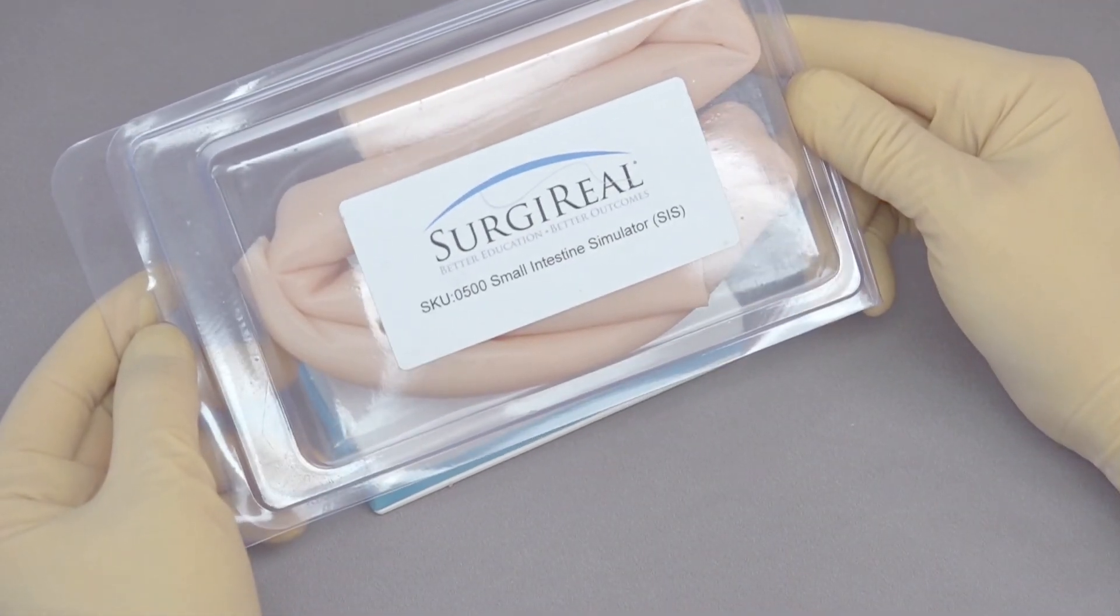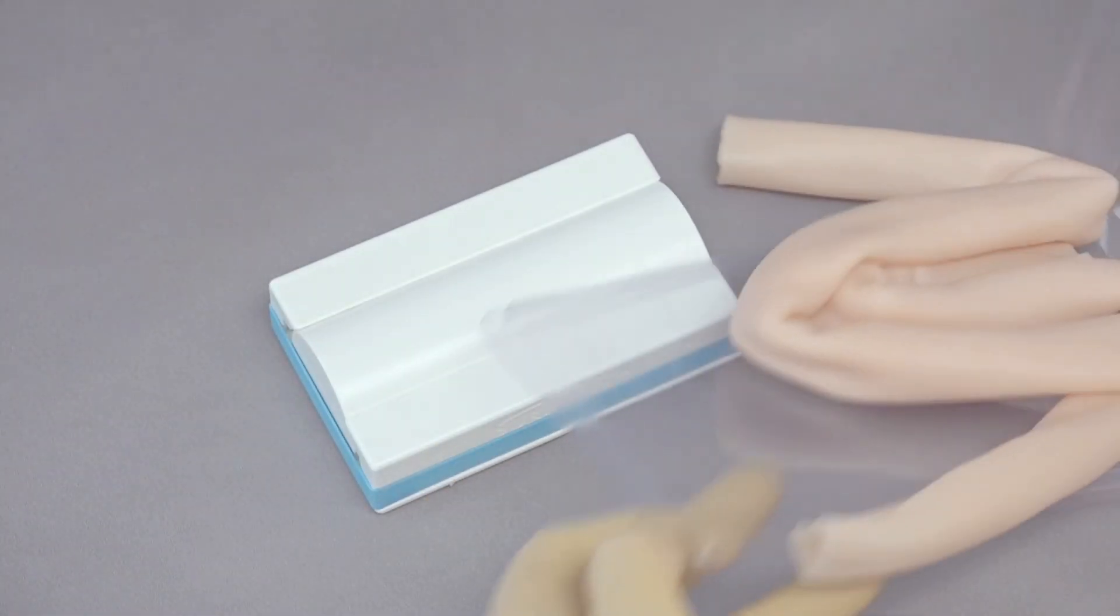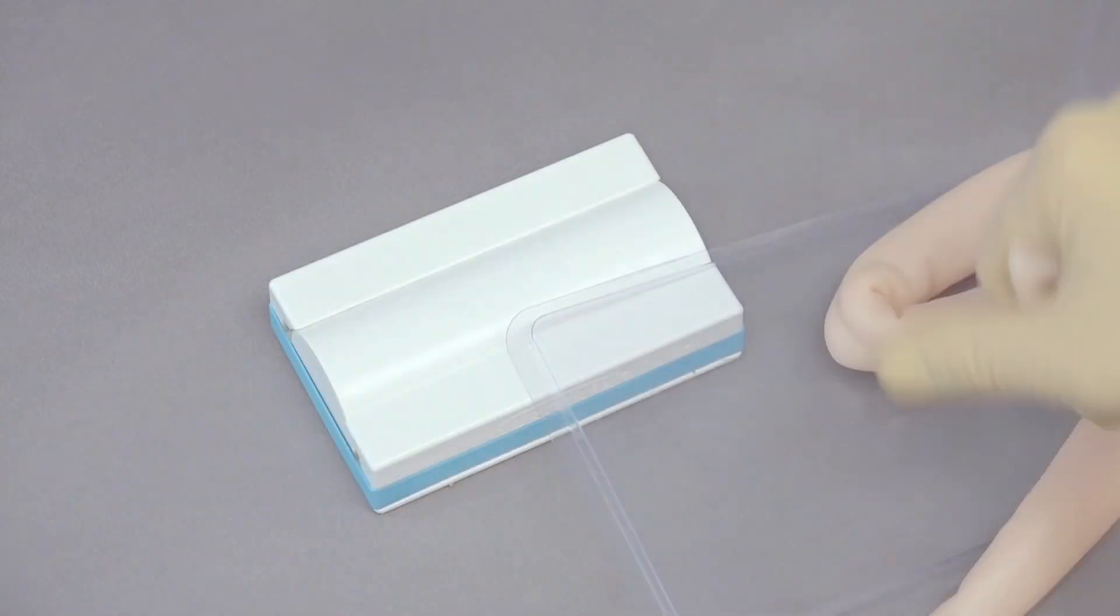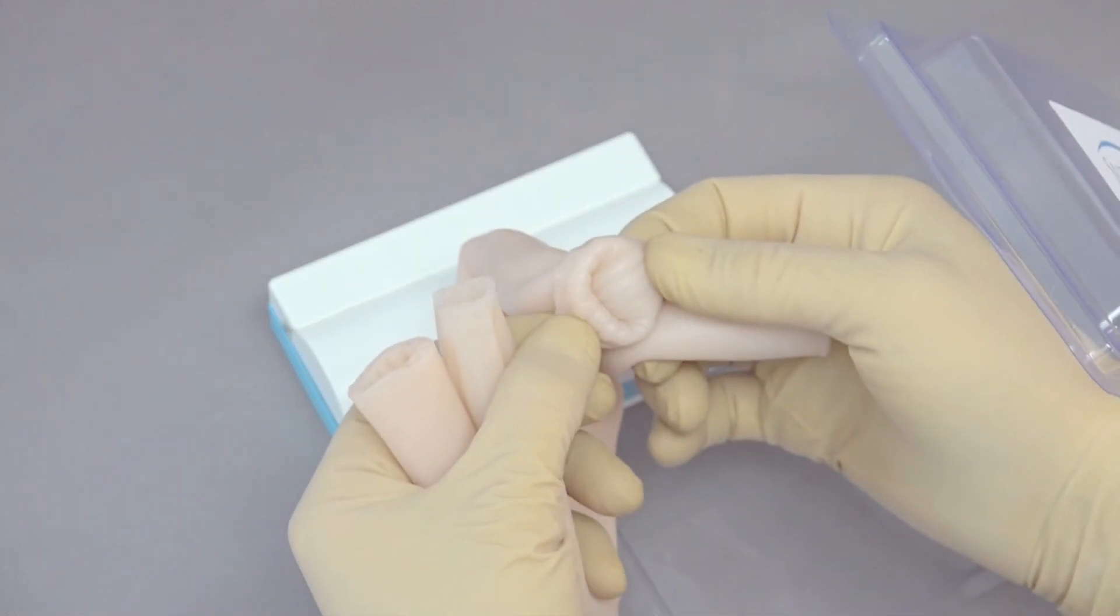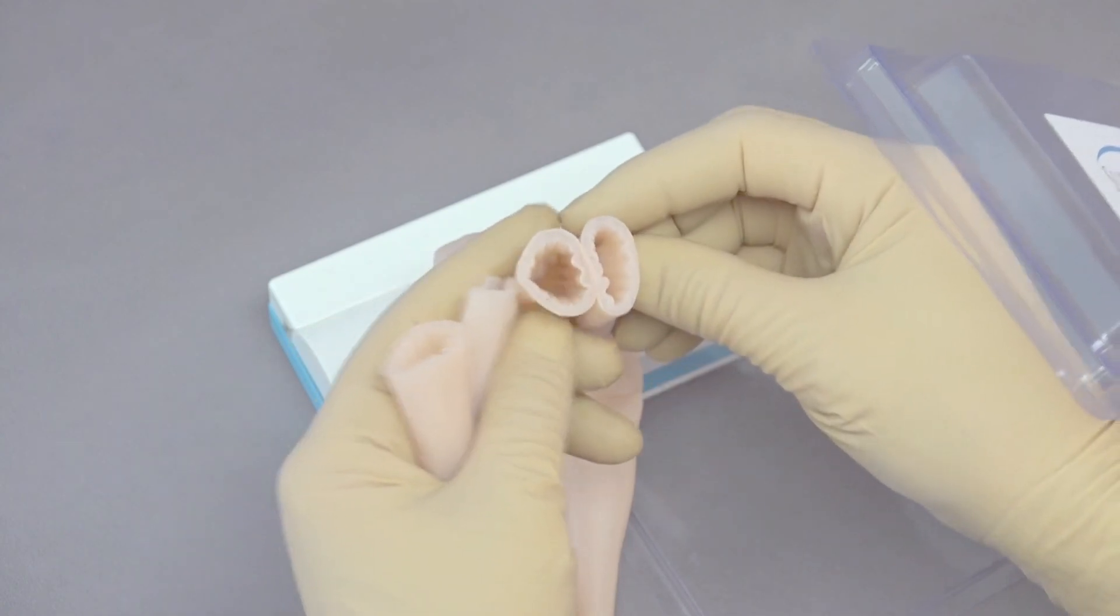We're going to suture using the SurgiReal Small Intestine Simulator. The Small Intestine Simulator comes with a couple of different lengths of intestine, actually they're the same length, that we can use. It has the internal mucosal layers so you get a feel for what that's like and can work very well.